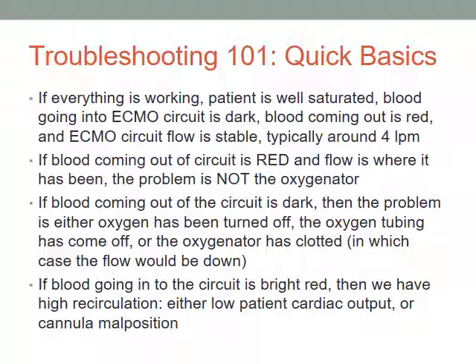So when you're assessing a patient, what does the blood look like? The reason you want to know that is so that if there's a problem, we can say, that's not the way it looked before. It used to be dark and red, and now they're both dark. It used to be dark and red, now they're both red. You don't want a situation where you say, that doesn't look right, but I don't know what it looked like before. You don't need gases very often in an emergency. You need to just do it quick. You need to know where you were and what it looks like now.